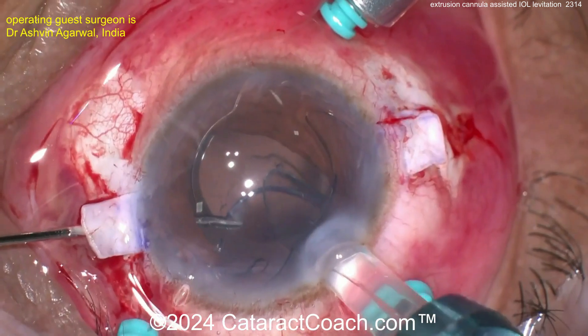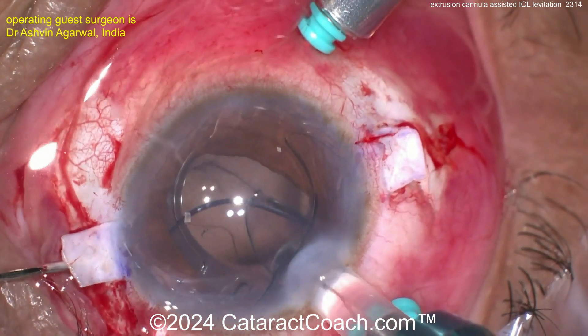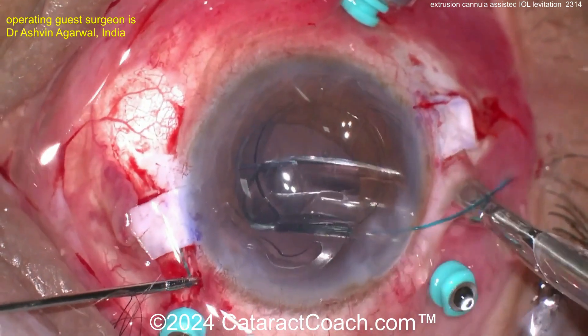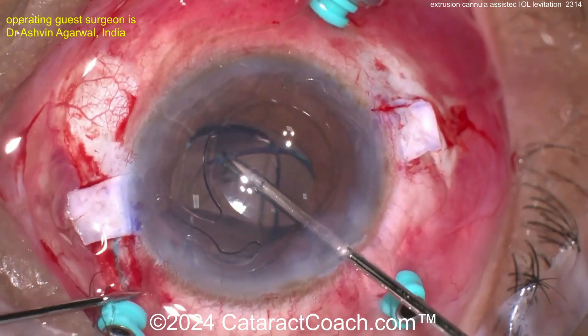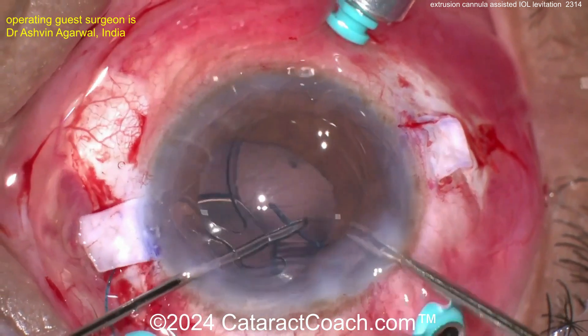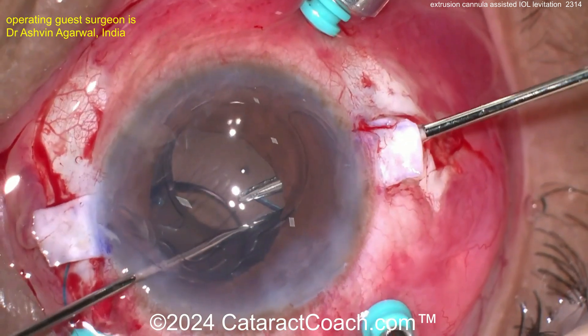Now the new lens is going in. There's the handshake technique getting that haptic out — very nicely done. This is kind of like a Yamane, but this is the glued IOL technique, which is a fantastic one that's been around for a long time. Again, handshake technique — there it is on the other side.